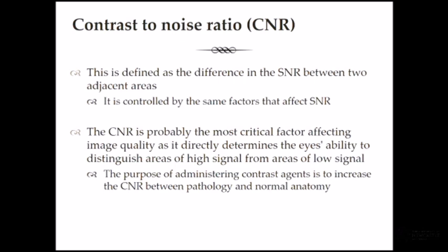So when we inject contrast media into someone's vein and then we image, essentially what we're imaging is the increased contrast uptake to a tumour. Because gadolinium brings about pronounced T1 shortening, we do T1 weighted scans post-contrast, and that makes anything that takes up contrast appear bright.